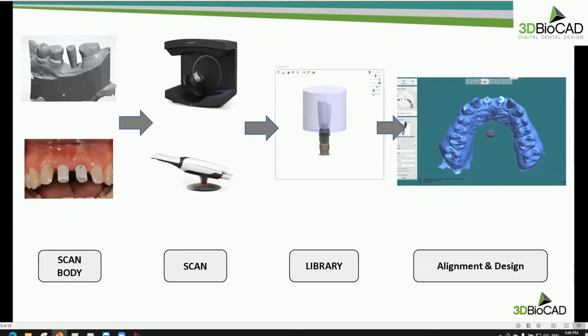Let's talk about the impression with the digital workflow. We saw how the Dr. Park used a 3D intraoral scanner, and we didn't know about that. And what I want to point in here is this. So the first step, always we should understand and we should use scan body. We call the scan body. Someone calls scan abutment. Someone says some scan flag, but mostly we call the scan bodies.